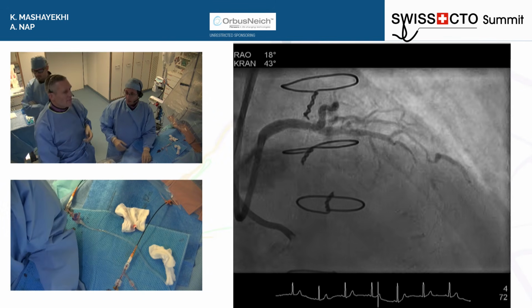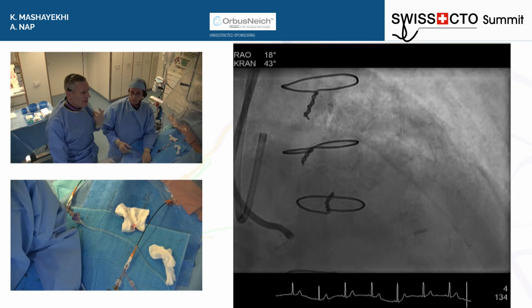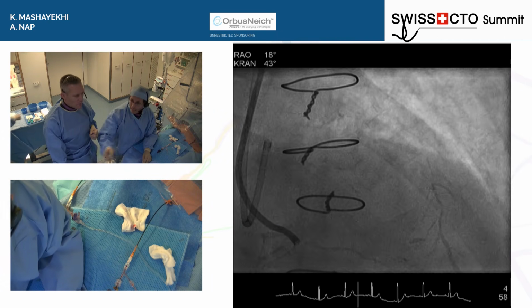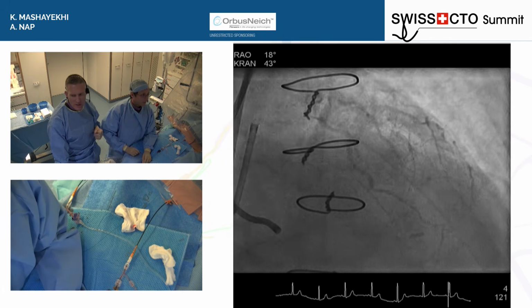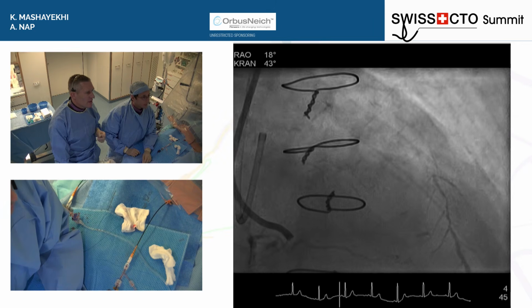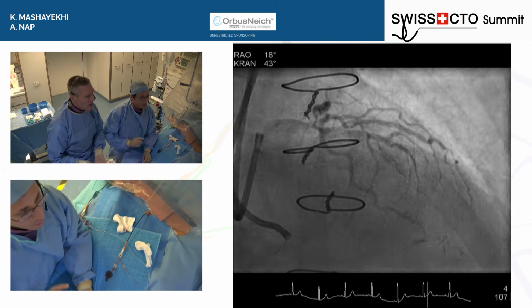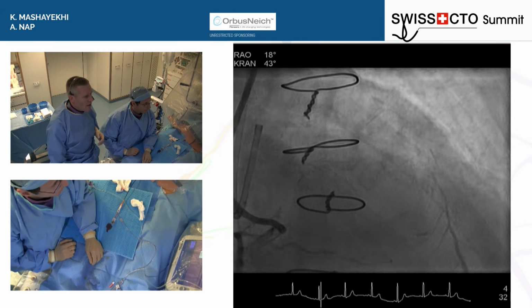Yeah. So now you have all the data in your hand and in front of your eyes. So just a question, who will start antegrade here in the room? Okay. So who will start retro? Yeah. So we're just asking the room about our common strategy.